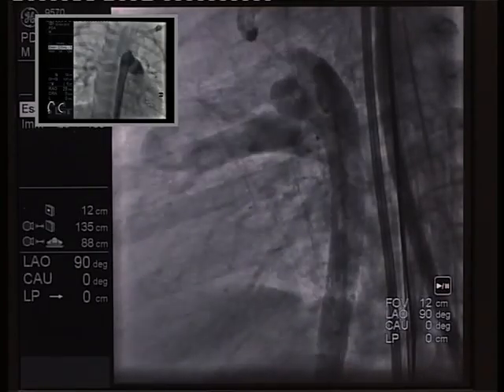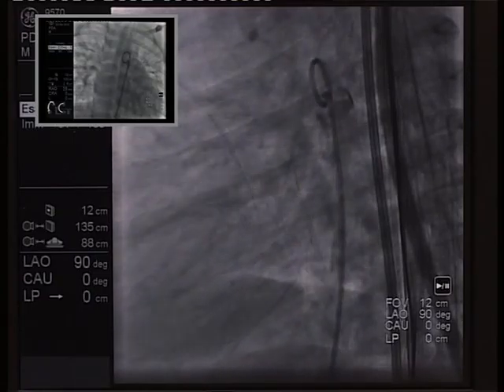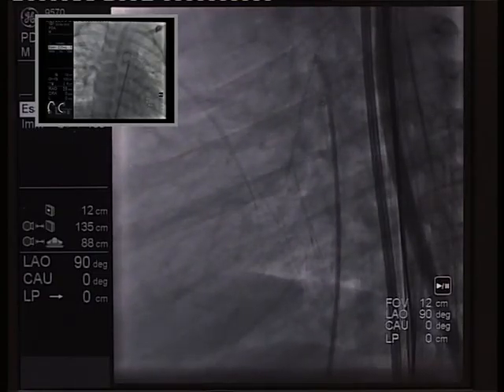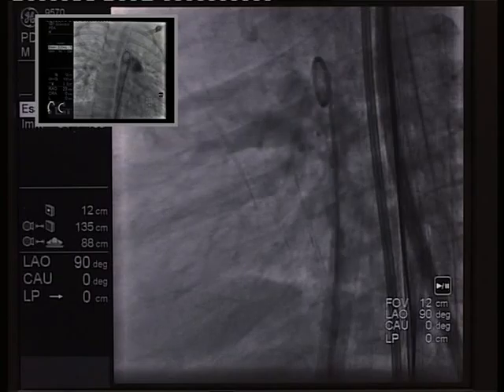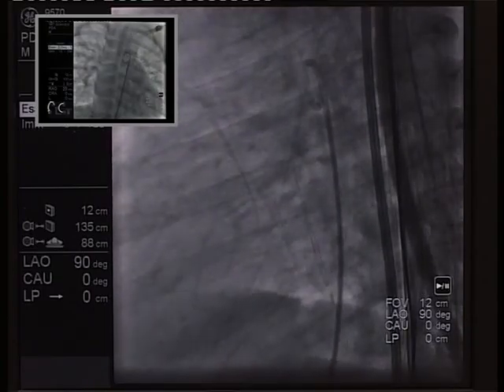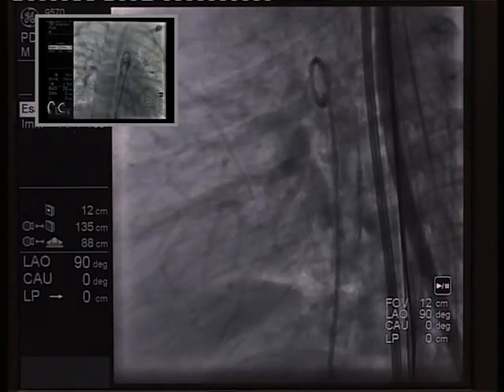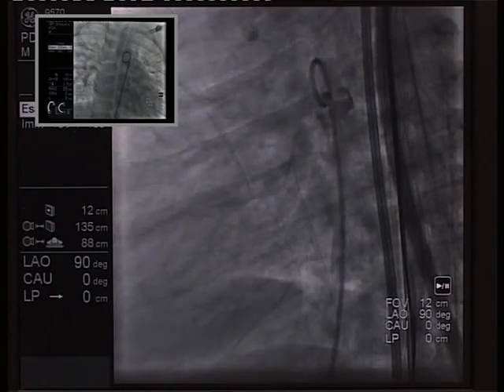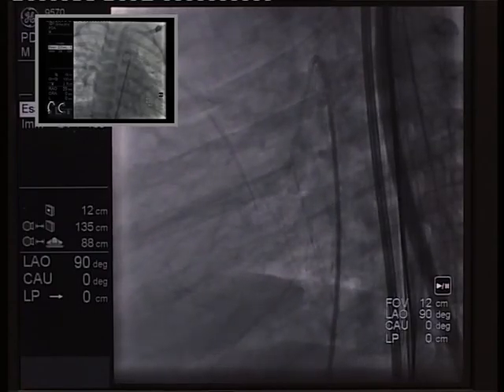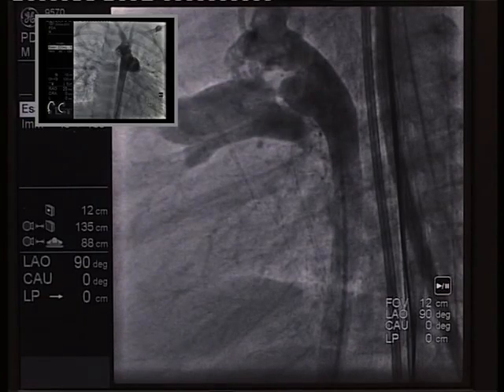We cross the arterial duct from the arterial side and try to put in this conical arterial duct an ADO 2 AS, 5 mm, 2 mm long device. This procedure will be performed by my colleague Giampiero Gaio.